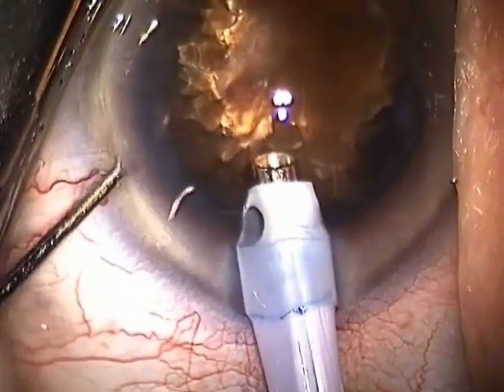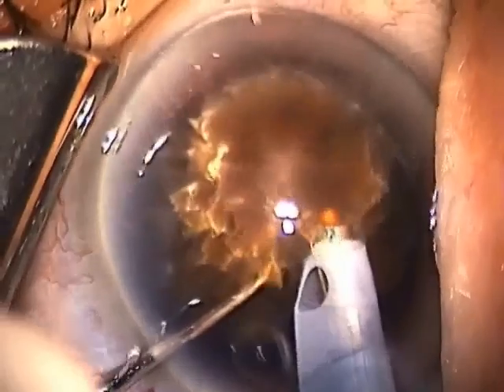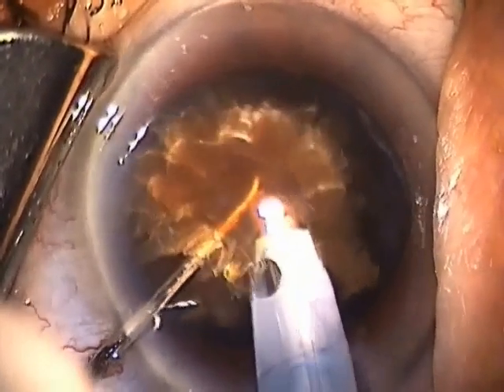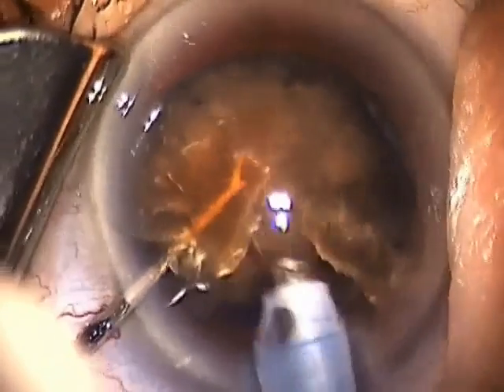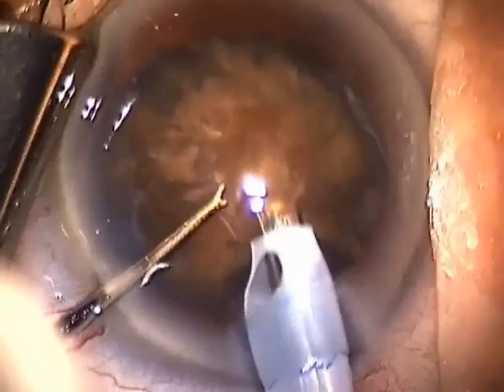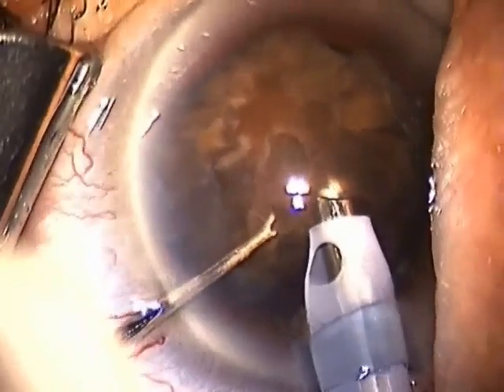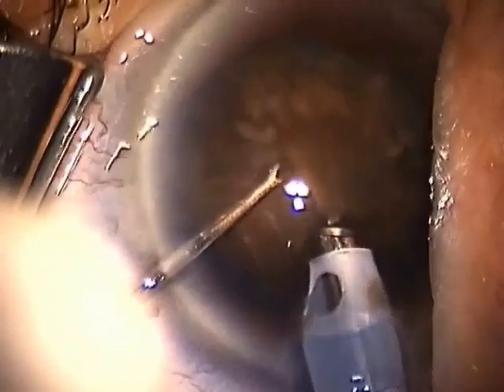This is a series of seven cases on one clip, running about nine minutes. These cases demonstrate the exquisite control power of the Stellaris FACO unit. Having used so many other FACO units, I truly believe this is the most efficient FACO system available in the world today. With the ability to do sub-2mm incisions, you can really do true microincisional surgery with this system.